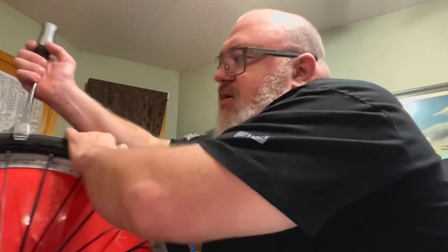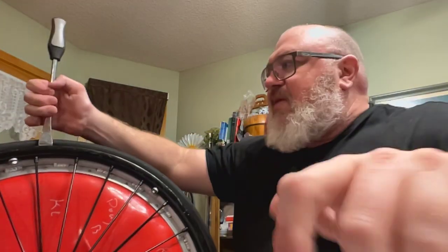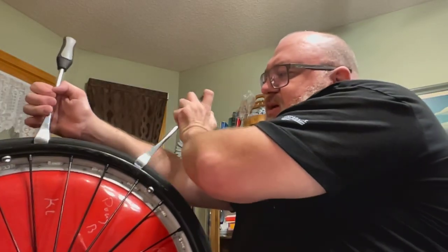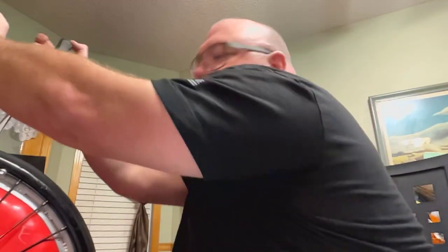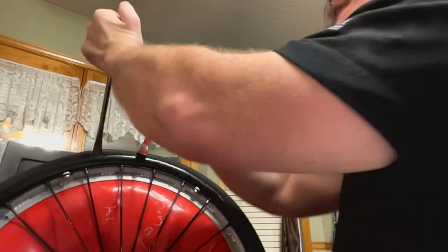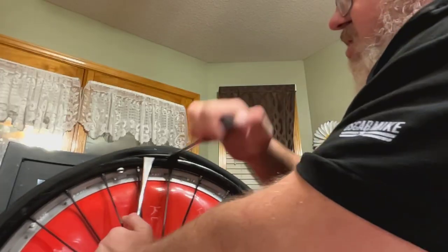So the way I do it is I go grab one. I try to get it under one of the spokes or by one of the spokes. And then I go grab another one and try to get it there. This should be really interesting because I have no leverage to be able to show you. But you kind of bend back. Let me find a better angle. And you're going to see the chair completely fall backwards. So find an angle, get one started, get the other one started.